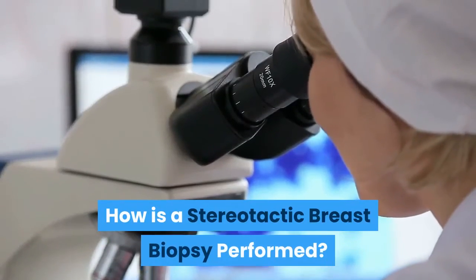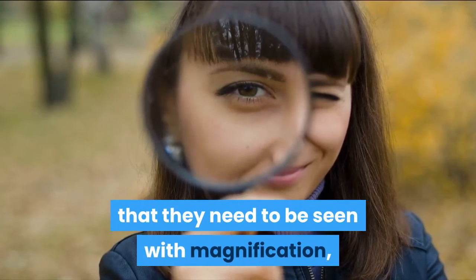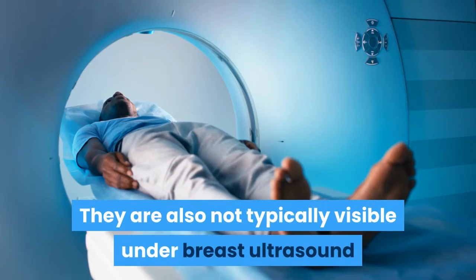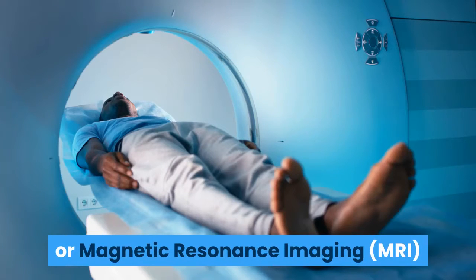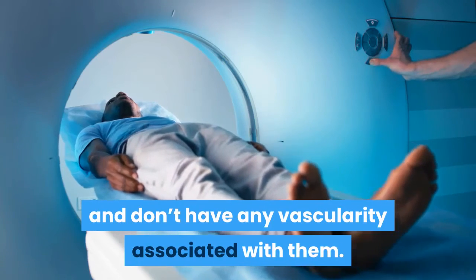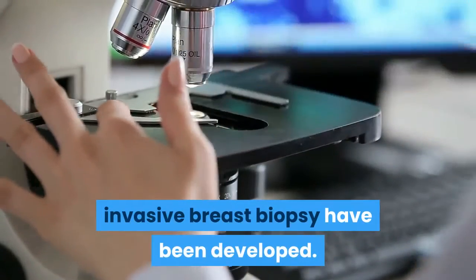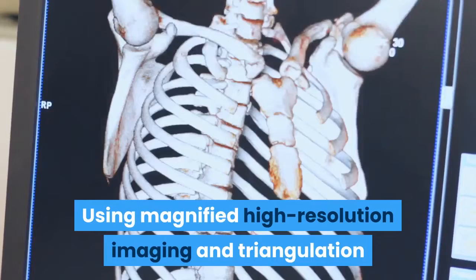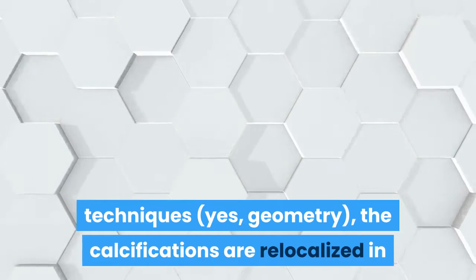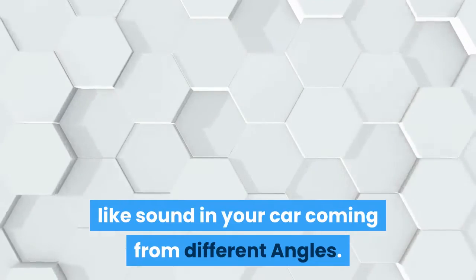How is a stereotactic breast biopsy performed? Since the calcifications may be so subtle that they need to be seen with magnification, they cannot typically be felt. They are also not typically visible under breast ultrasound or magnetic resonance imaging, MRI, because they do not have any measurable mass and don't have any vascularity associated with them. Therefore, special means of performing a minimally invasive breast biopsy have been developed. Using magnified high-resolution imaging and triangulation techniques, yes, geometry, the calcifications are relocalized in 3 dimensions called stereotactic, like sound in your car coming from different angles.